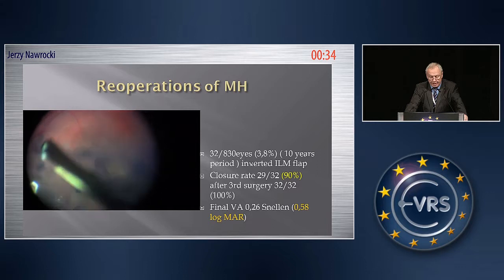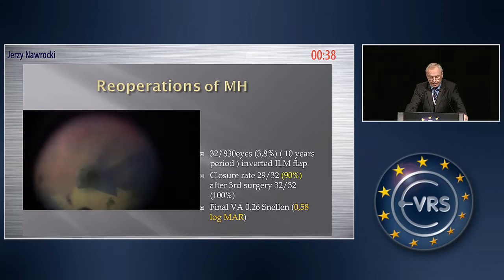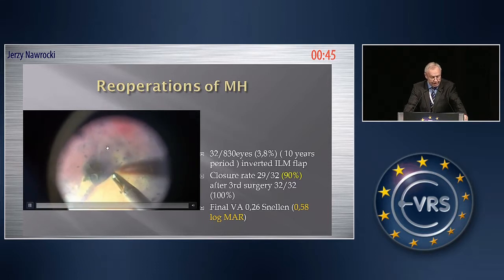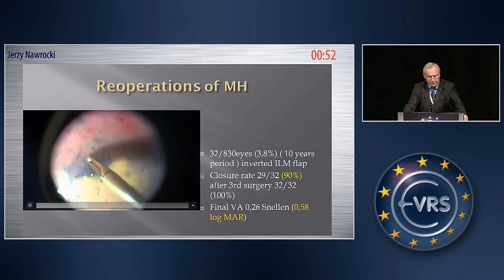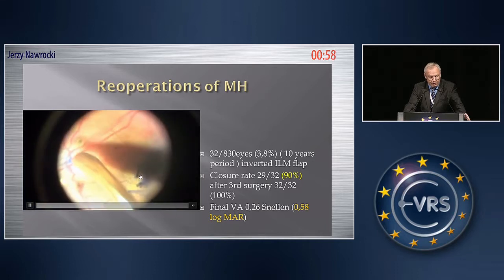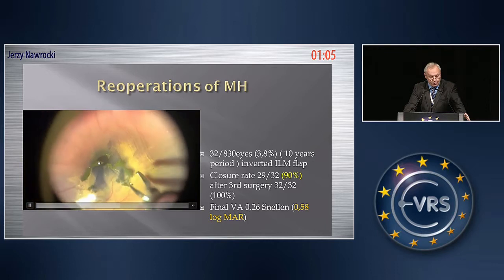Reoperations are rare. In our group of patients, we had 3.8% reoperations, 32 cases in 830 macular holes. And why do we reoperate? The cause of reoperation is that the flap moved away from the macular hole, and if you look at the reoperation, you simply put it once again on top of the macular hole, but it may move away also during silicone oil injection.